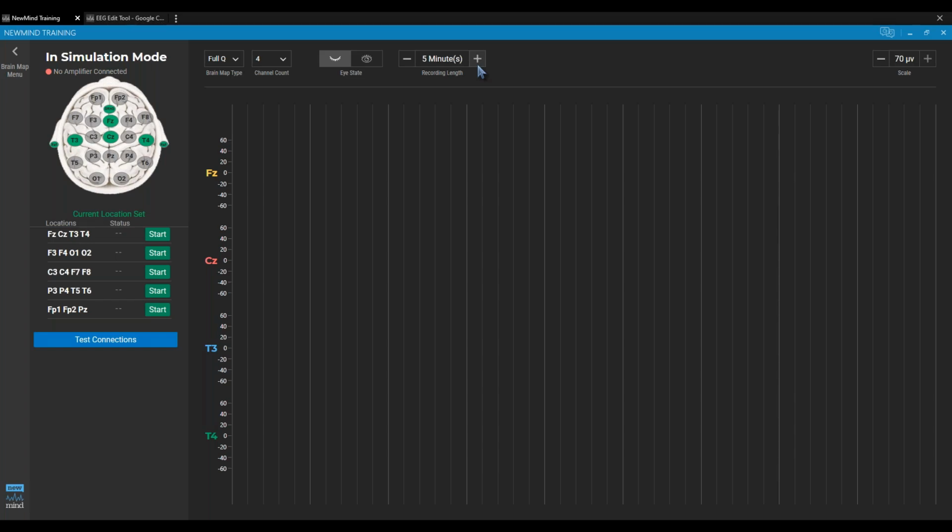Hey, Aaron? Yep. I just had a thought on somebody like your dad, where artifact is part of his life. If you just left it in and then remapped him and see if there's any decrease in the artifact, I'm not sure how you would exactly do that, but if the map shows some change for the better, that may be a question. With him it's due to the stroke, he's got heavy beta spindling in the front.